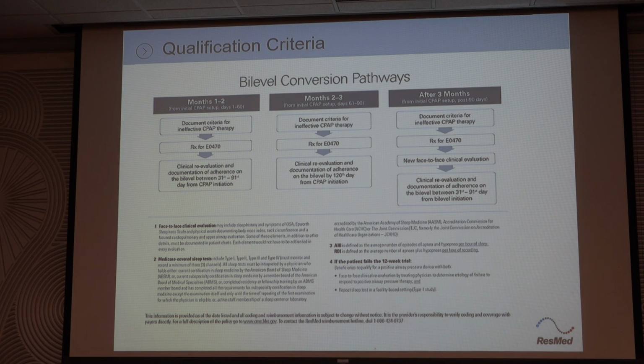And I used to have patients that would try to put a potato on the end of the mask and try to fool it, and I had to explain to them there's breath detection it's looking for, so you can't do that. Actually, one of the first patients we set up on an auto, I remember she called in and said, hey, can you come pick up my machine? I'm done with it. I go, well, let me call the doctor and get a DC, discharge order, for that, and then we'll come out and download it. She goes, what do you mean download it? Well, we'll see how much you used it and how you did. Oh, can you come back next month?